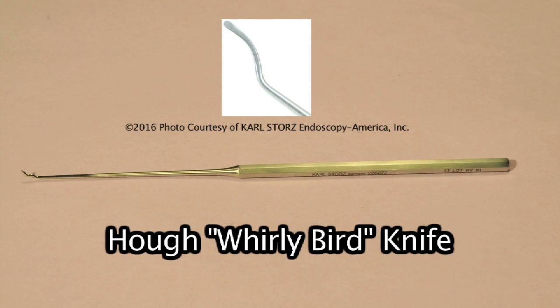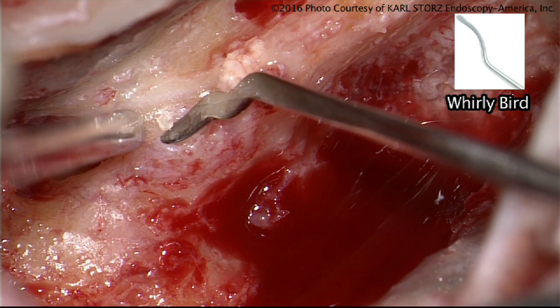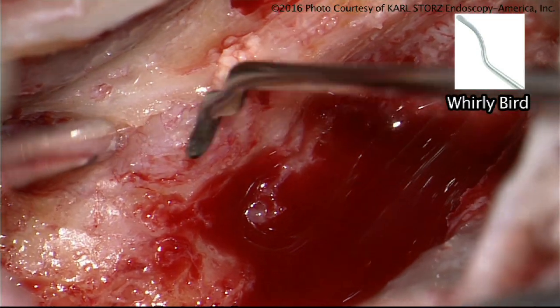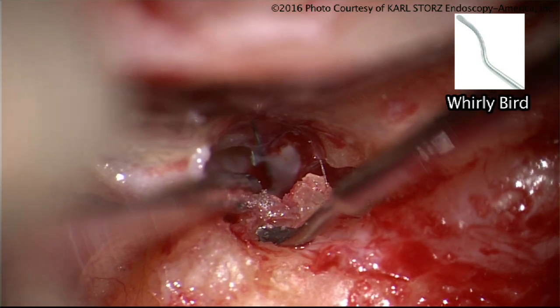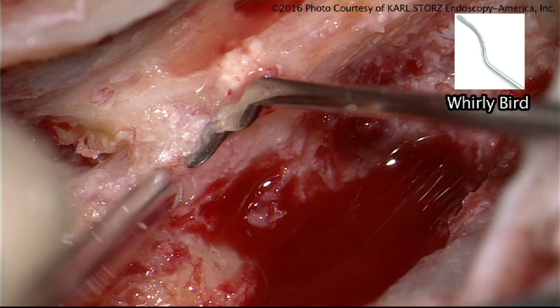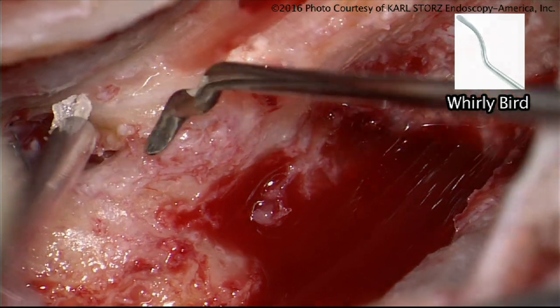The whirlybird comes in two kinds: a very thin whirlybird and a heavier whirlybird. I use this in facial nerve decompression — it was designed to dissect cholesteatoma, and it's a fairly robust instrument with a lot of strength. After you remove bone down to an eggshell thickness on the facial nerve, I use this to chip off the bone as a final way to decompress the facial nerve or to mobilize it in the infratemporal fossa approach.